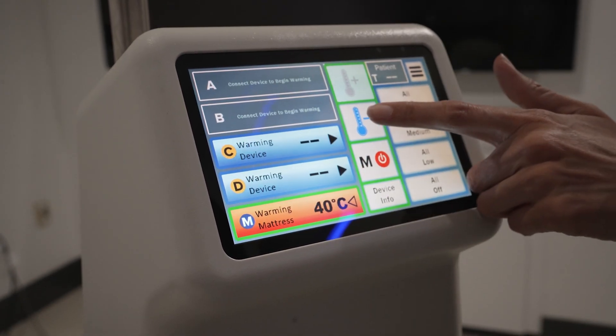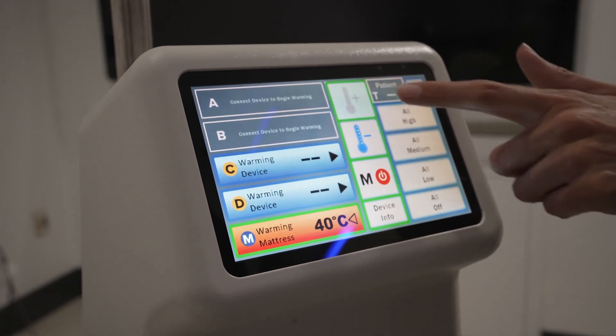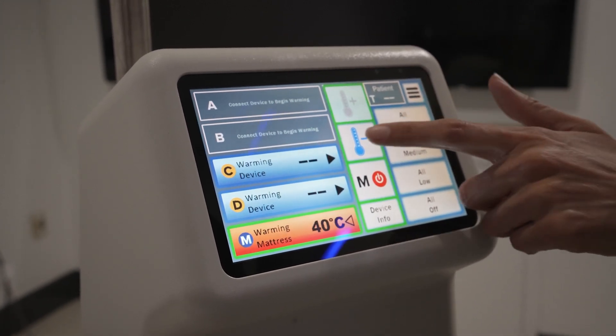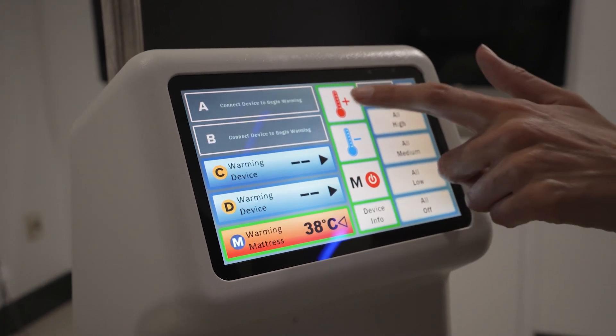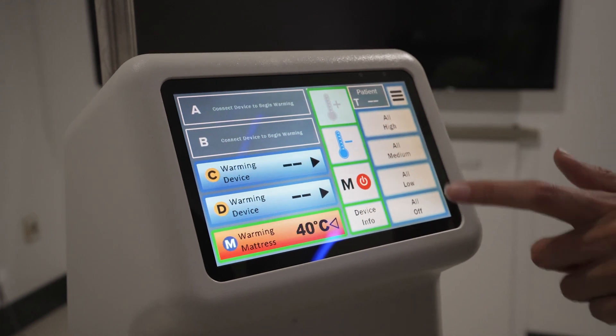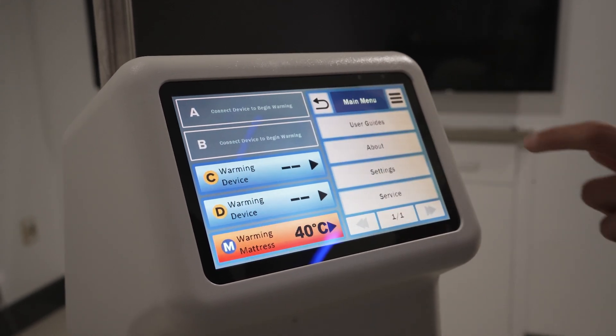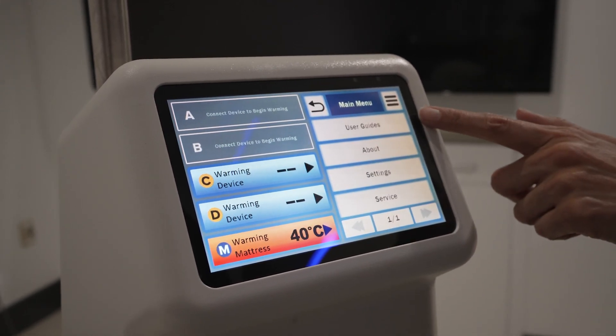Other functions of the 7-inch touchscreen controller include the ability to adjust settings, review user guides, and service checks. The controller can clamp directly onto an IV pole with the included hardware. If desired, there is also a wall mount or a rolling stand available.